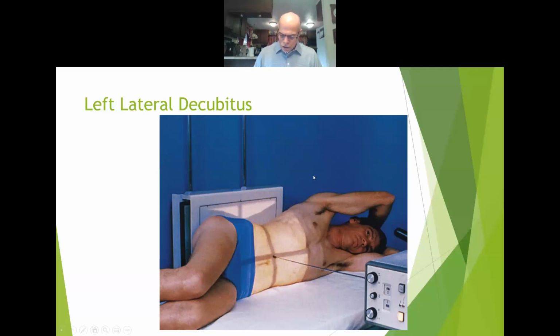Exercise care to ensure that the patient does not fall off the cart or the table or the bed. Make sure if you're doing it on a gurney, on the hospital bed, all the wheels are locked because we do want to keep our patient in this position for a few minutes.